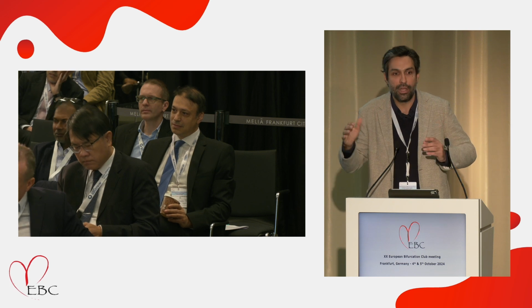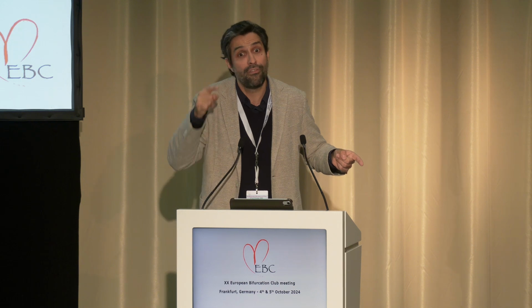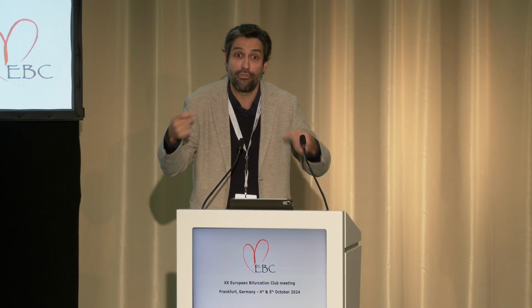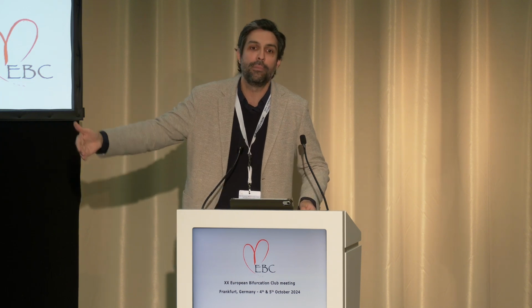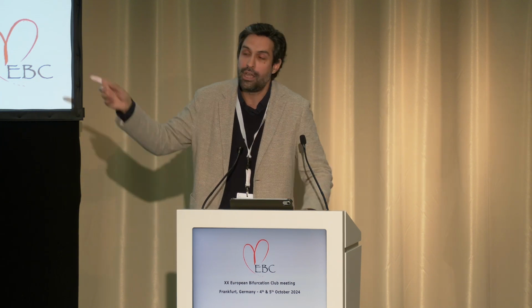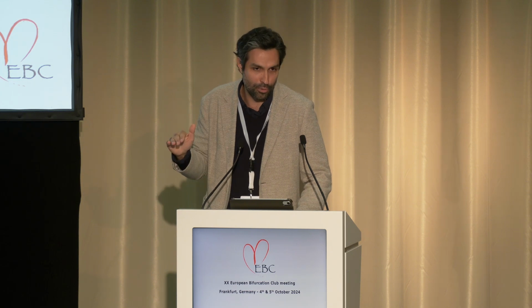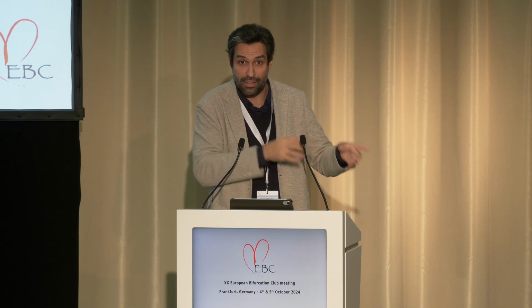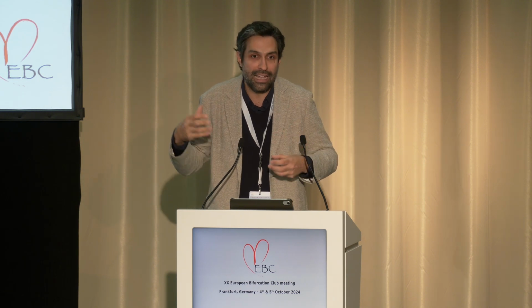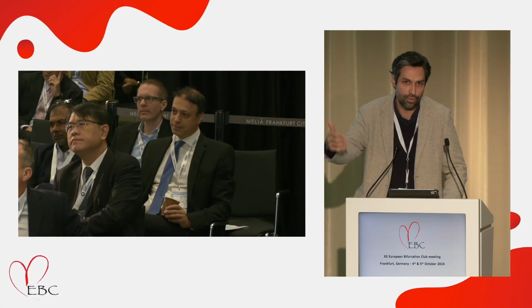Now we're teaching them, listen, forget about the radiation, because what is going to happen is that in the cath lab, we're going to give 5, 6, 7 times more radiation. So it's better for us that you make a diagnostic exam that we can use, so that we spend less time in the cath lab. They started to understand that to look at calcium, and perhaps you can talk with your radiologist, you need to use 120, 140 kVs, otherwise you cannot look at the calcium. These are small details, but both communities, the interventional community and the radiological community, are understanding that CT is beyond a diagnostic test, and we're using it for planning, and that's going to be the future.